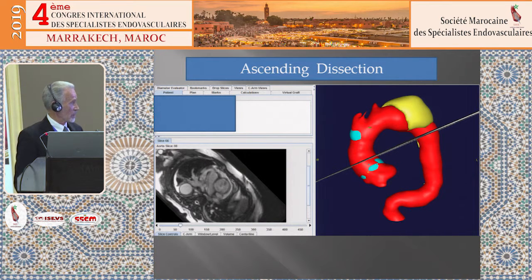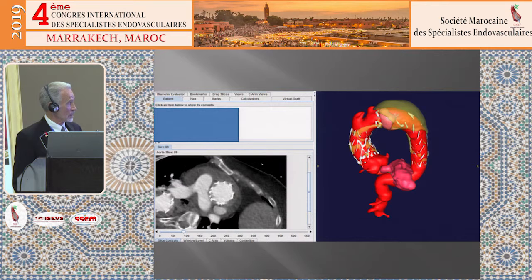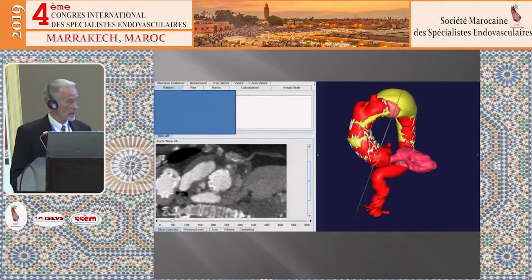So another patient with an MR came into the emergency room and had this image from an outside institution. You can see the disruption, and this is that same patient who had not only the ascending repair, but then after that a descending repair so that it can keep going serially around the aorta depending on what the anatomy is. It's another patient who was treated after a TAVI valve case.